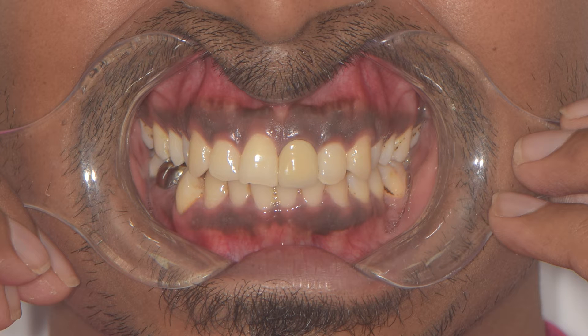This is the case of a 28-year-old male who reported with a PFM crown on the 2-1. That's what got him to me and he requested it to be changed with a more aesthetic alternative. You can see the gross mismatch in the shade as well as the shape. Matching a single crown to adjacent natural teeth is one of the biggest challenges in dentistry today.